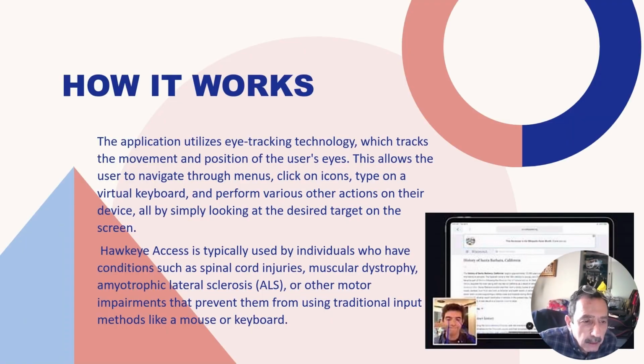So the application utilizes eye tracking technology, which tracks the movement and position of the user's eyes. This allows the user to navigate through menus, click on icons, type on a virtual keyboard, and perform various other actions on their device, all by simply looking at the desired target on the screen.